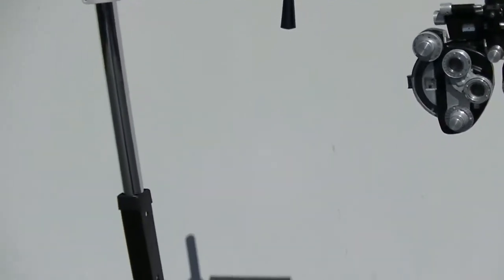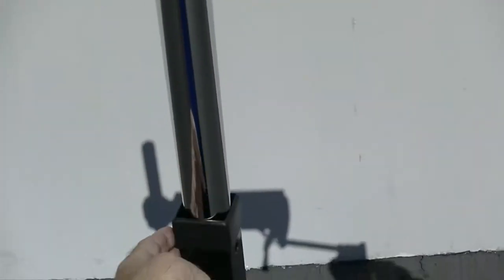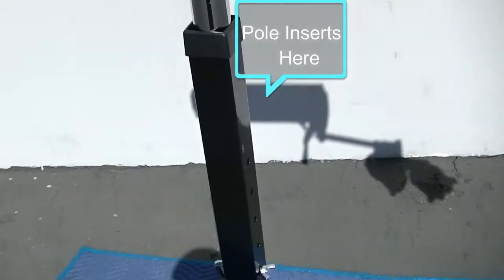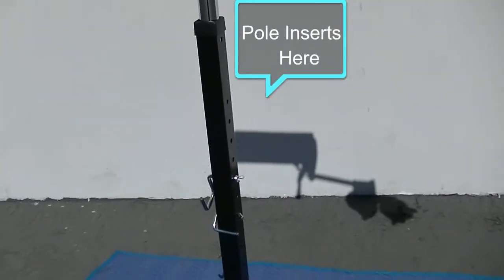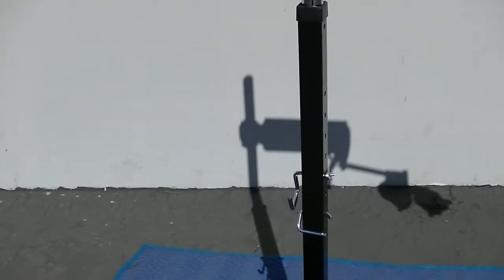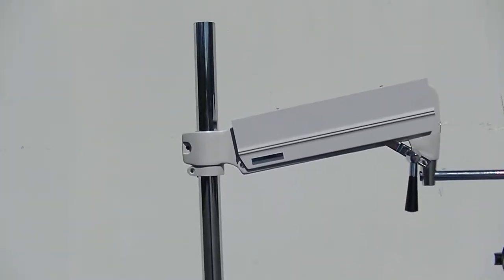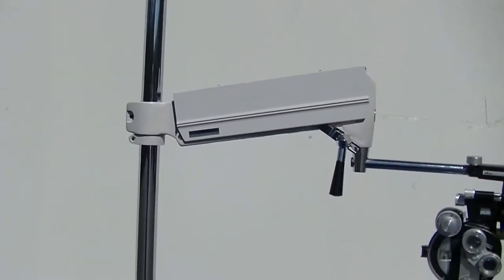You can keep the pole inside the metal 2x2 support rack and just haul it that way — it's very light, only about 25 pounds. Or you can take the pole out and take the phoropter arm off the pole if you want to make it even more compact.